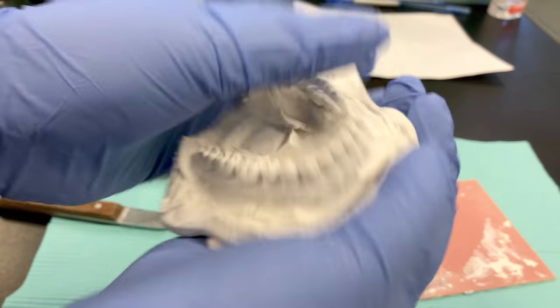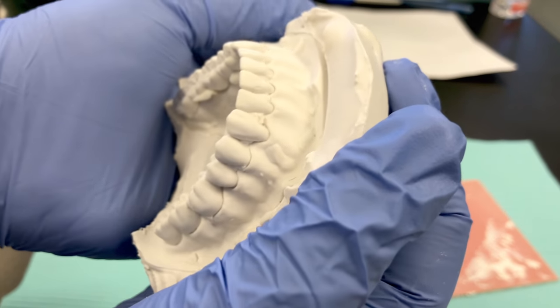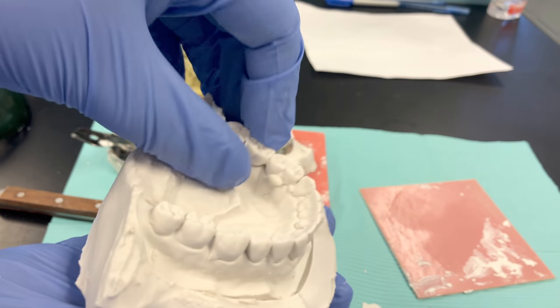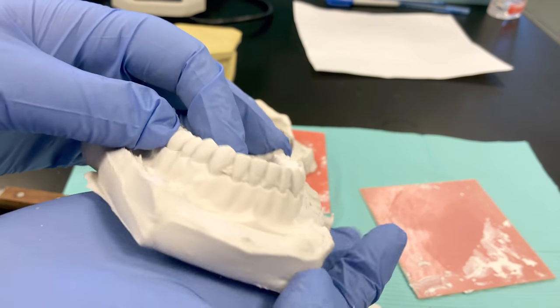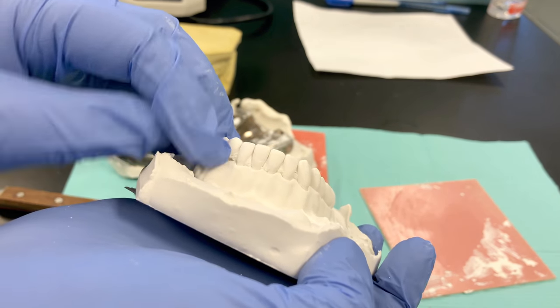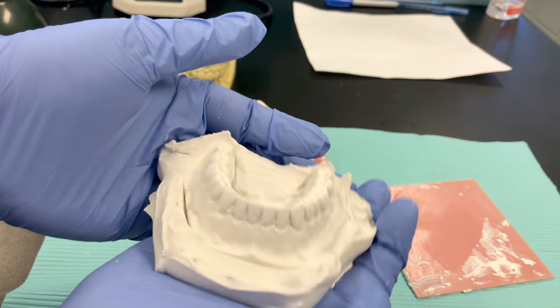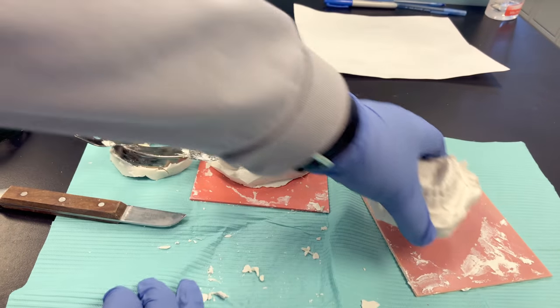With the impression removed, we can take a look at our results — looking for any bubbles on the teeth or any voids. So far it looks pretty good. Check out the occlusal surfaces and lingual surfaces. There's still some impression material stuck — that's an easy cleanup. You can use an explorer or thin instrument to scrape that out. This is a pretty good result; I don't see any bubbles or issues. This is a nice study model, though it still needs to be trimmed — that's a whole other skill in and of itself.